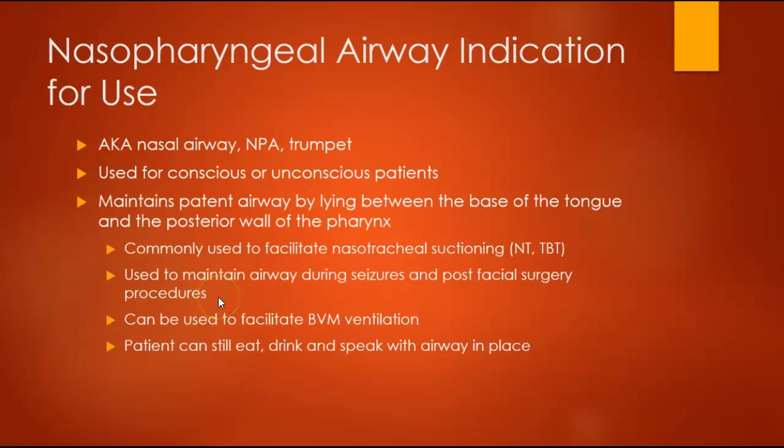It's also used to maintain airways during seizures or post-surgical facial surgeries. So if you've had facial surgery and you've had to have something sewn up or wired in your oral cavity area, you're not going to want to put an oral airway in. Nasal airways would be the way to go.